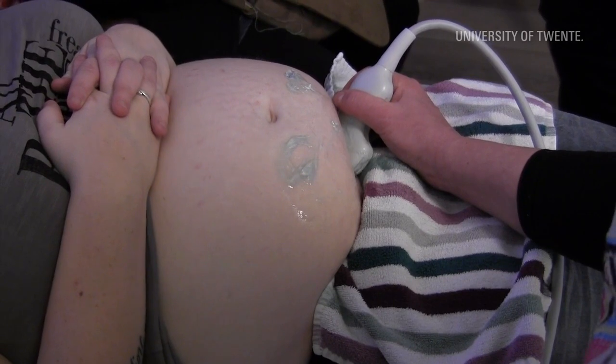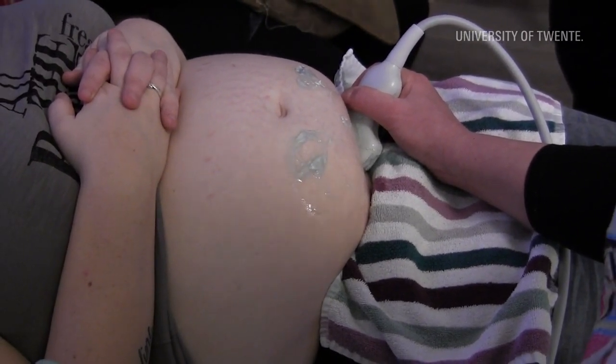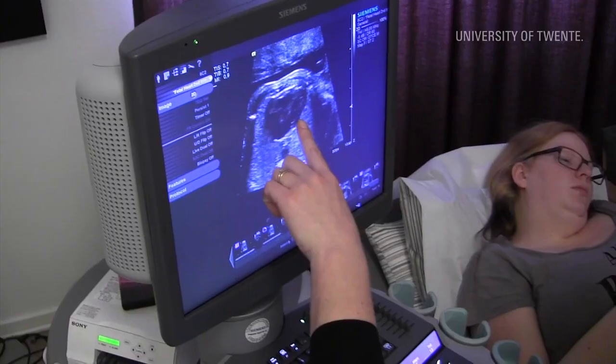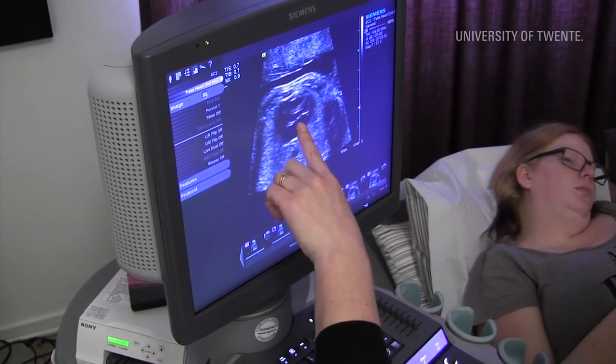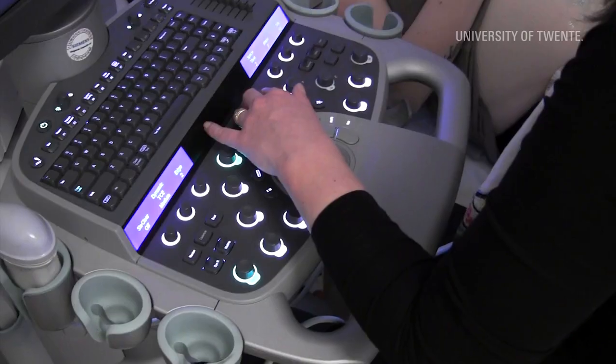For this application there are several technical tools to obtain the final image. The question in this case for you is to come up with technical ideas to have our image refreshing with enough speed to image the fetal heart while maintaining enough information on our image.